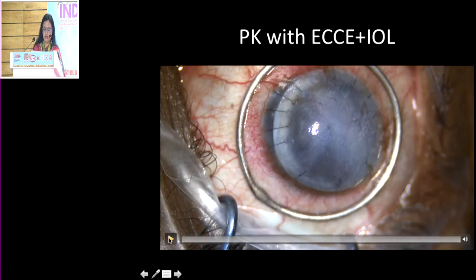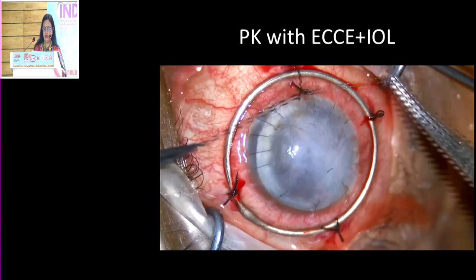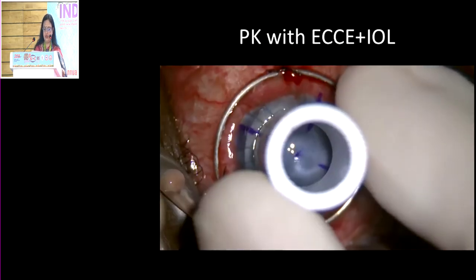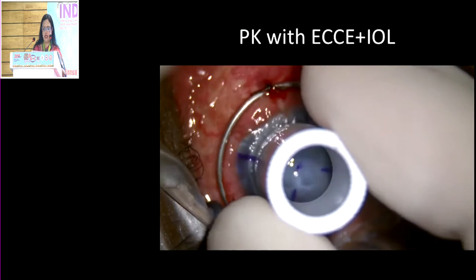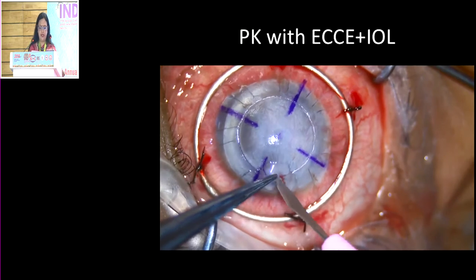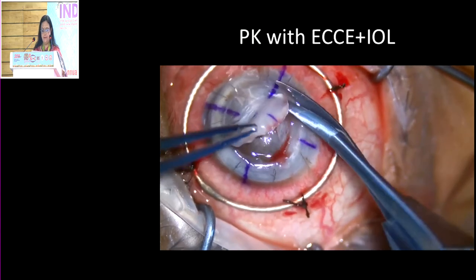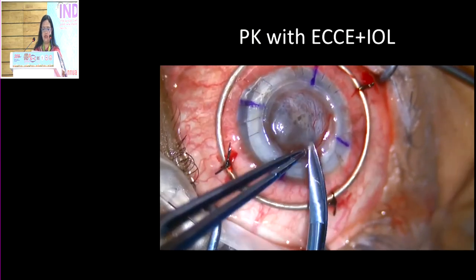This is one of my patients who had a therapeutic PK done, and now he was ready for an optical PK. The whole anterior segment was plastered, so we decided to go ahead with the PK — no lamellar procedure could be done. In this situation you might have a surprise; if you go full thickness you might actually be hitting the iris, so don't go too deep. Try to enter the eye using a knife such as a 15-degree blade. Using corneoscleral scissors, you can see the whole anterior segment is plastered.